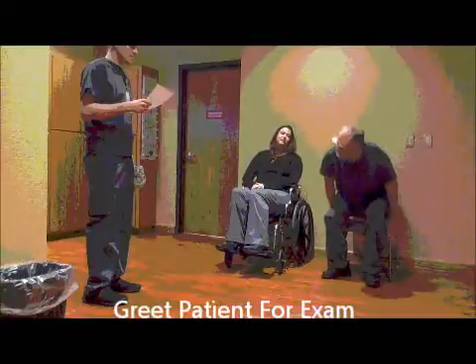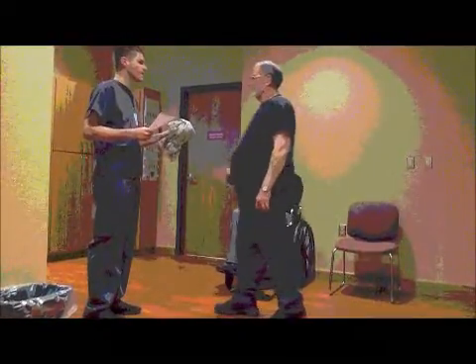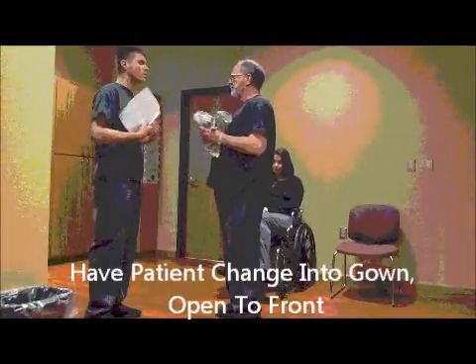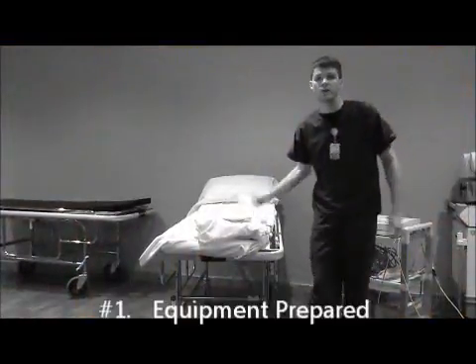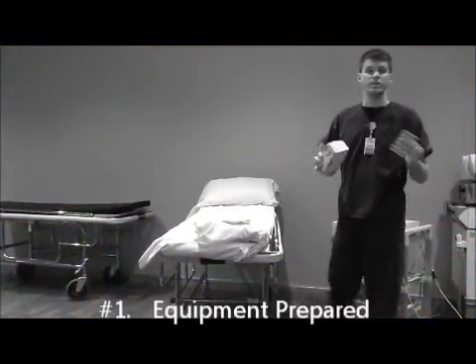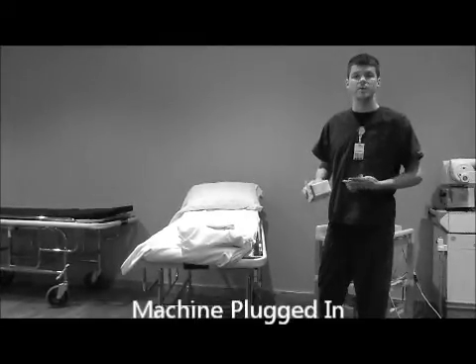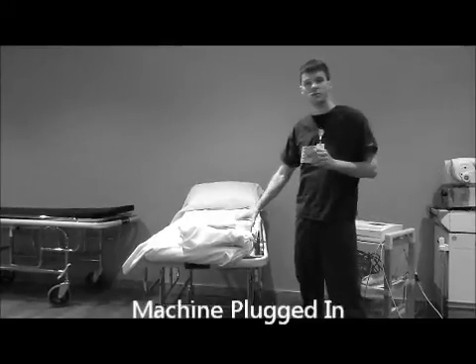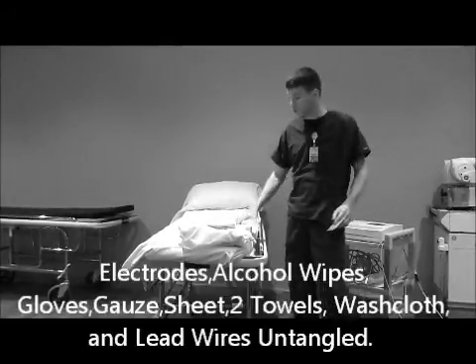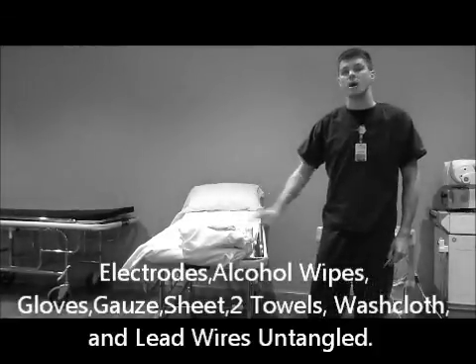Roger Cromwell, how you doing sir? Can you come over this way for me? Go ahead and change this gown for me — I need it open in the front. Once you've gotten your patient, you'll want to make sure you have all your stuff ready before you get them or while they're changing. Make sure you have your electrodes, your machine all set up, alcohol swipes, gloves, and some sheets and blankets to keep them modest.